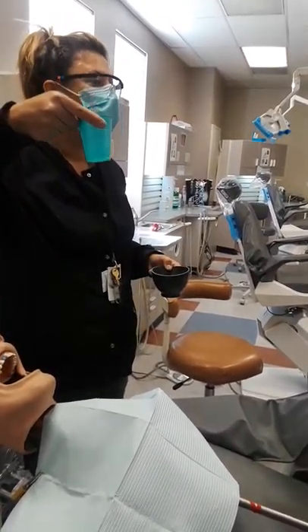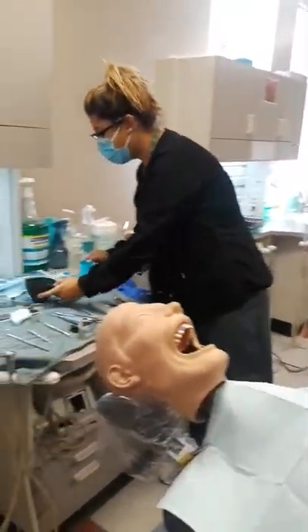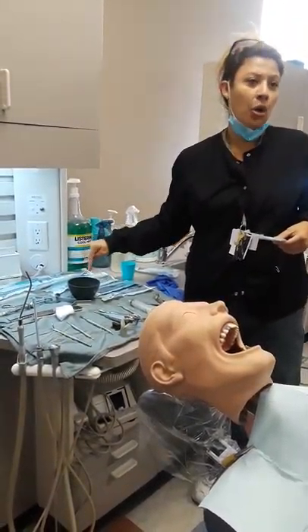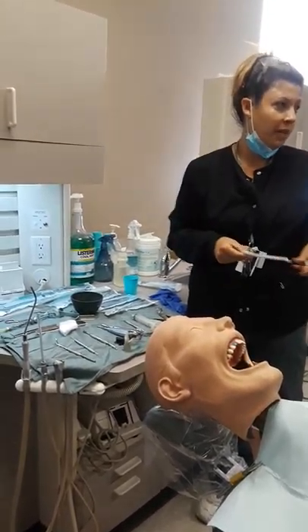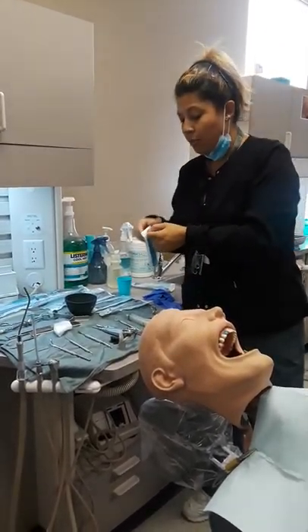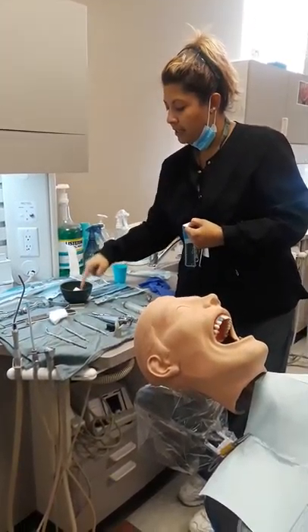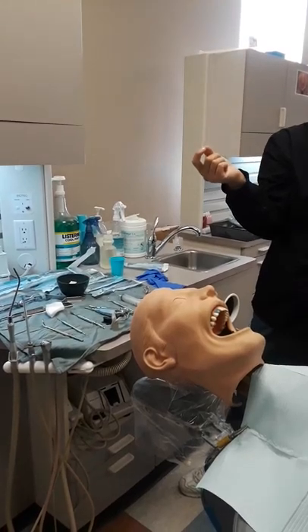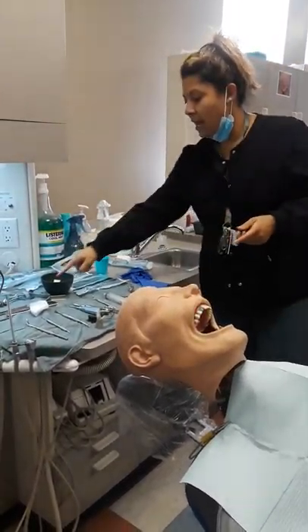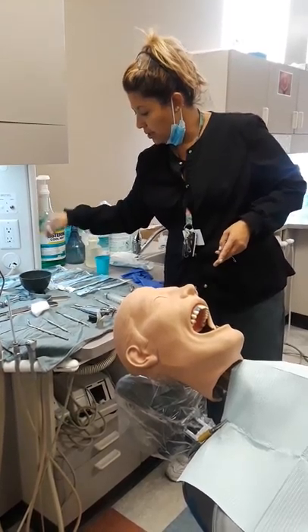The cup isn't stable, so you can't leave anything inside it. The bowl is more stable. If we go to surgery, your silk sutures should always be soaking because you always want the silk to be wet. You're going to open both packages and dump them inside and let them get moist — the more moist, the better it runs through blood, because blood is thick and it clots. That's why we have them soaking.